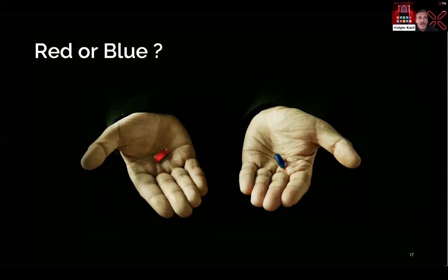And as Andrew nicely explained, the size of the printer and all those things make chairside immediate temporaries possible. And this ceramic crown material, which Andrew described, has a high content of zirconia, of ceramic, and that gives a very strong crown. If you do it like Andrew did, printing two crowns in one and keeping it, and the patient's crown breaks after half a year, you can just call him, he comes to your office, and you immediately have a new crown. That's also the difference with 3D printing.